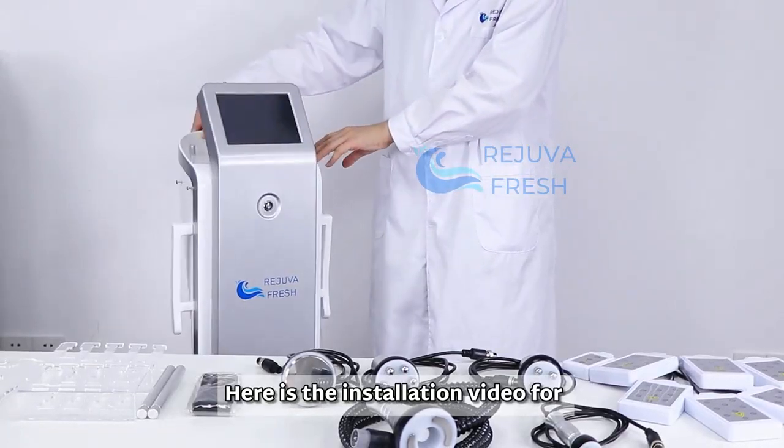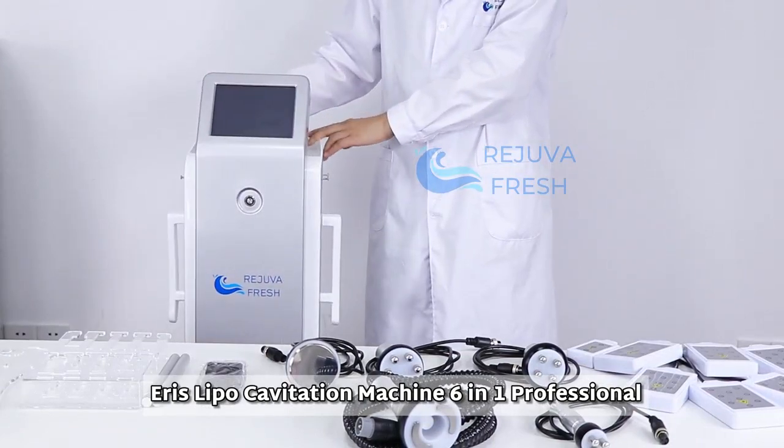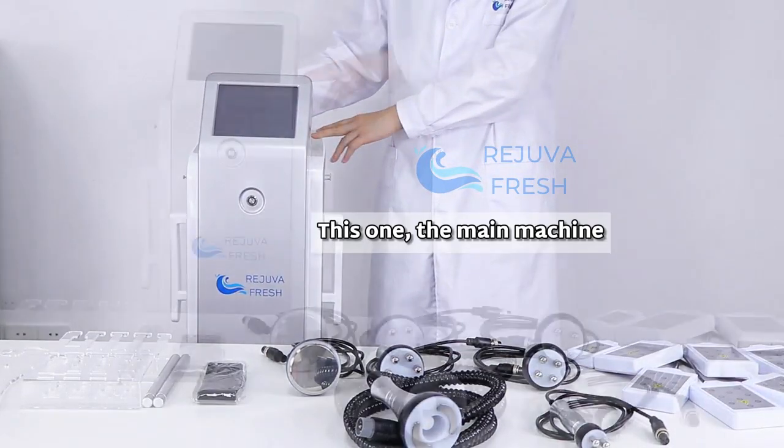Here is the installation video for the Eris Lipo Cavitation Machine 6-in-1 Professional. This one is the main machine. Here are the parts.